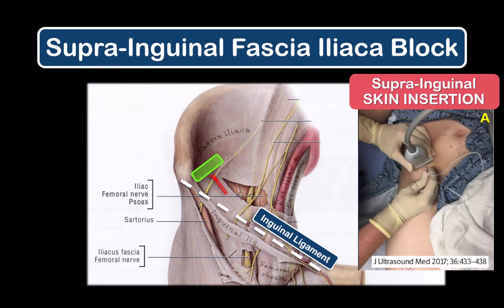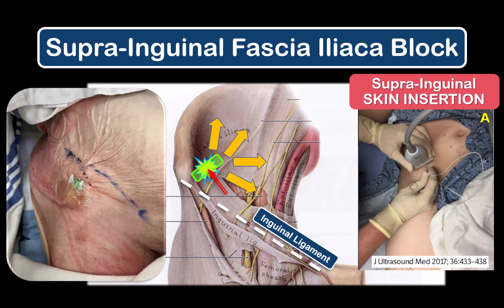I've described the principles and performance of a single injection suprainguinal fascia iliaca, or sci-fi block, in another video. Here, I demonstrate how to place a sci-fi block catheter using a suprainguinal insertion site.